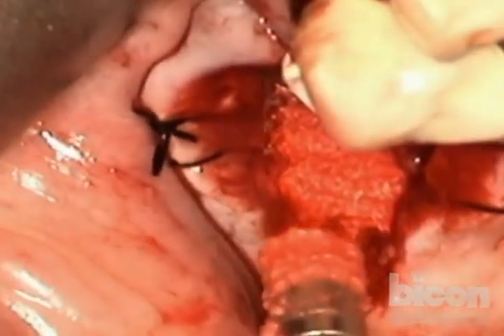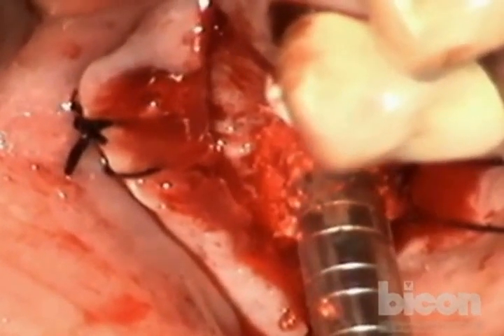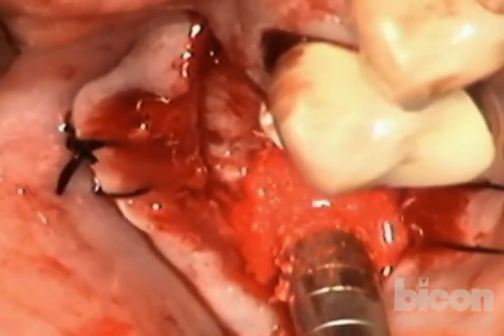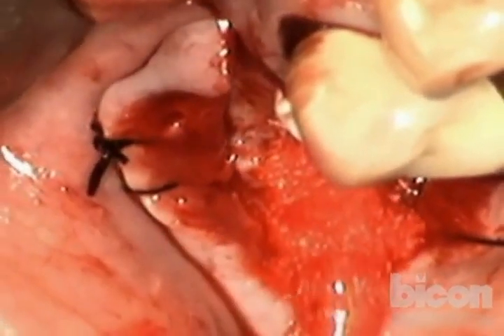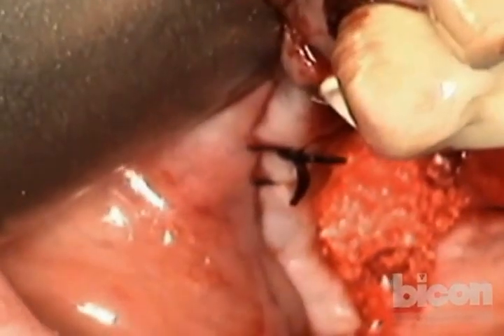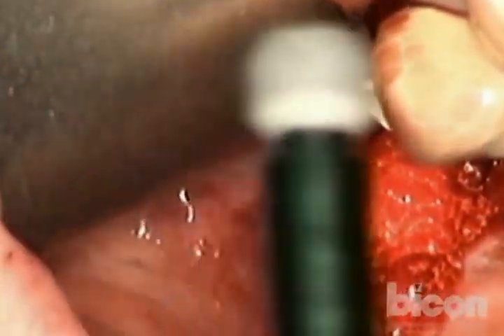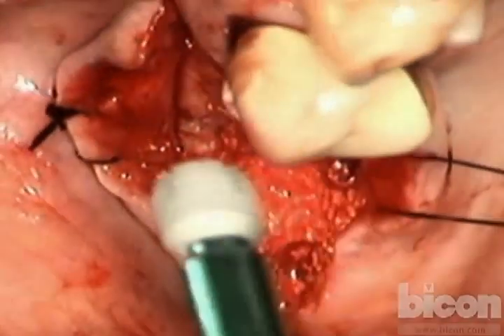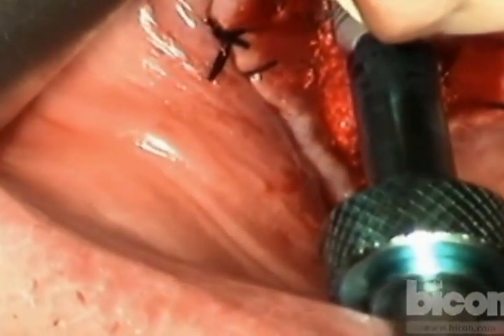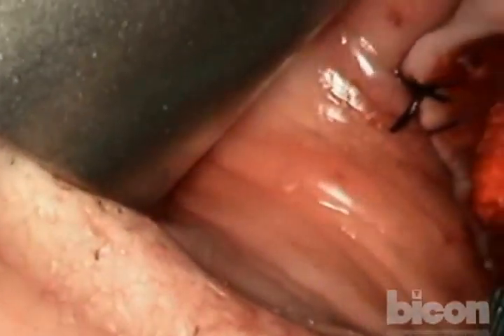And I do tend to overfill it a little bit, because this action right now is what is lifting the sinus floor. We've mobilized it before, we've pushed it up before, but this is really... let me have that, and we will imbibe some of the liquid, and then we will go ahead and place our implants, first the anterior one, and this is a 5 by 6 millimeter, goes in, right, and the front end of that mallet, please. Retract a little bit more, Janet. Turn slightly to the left. A little bit of tapping. Yeah, very good.